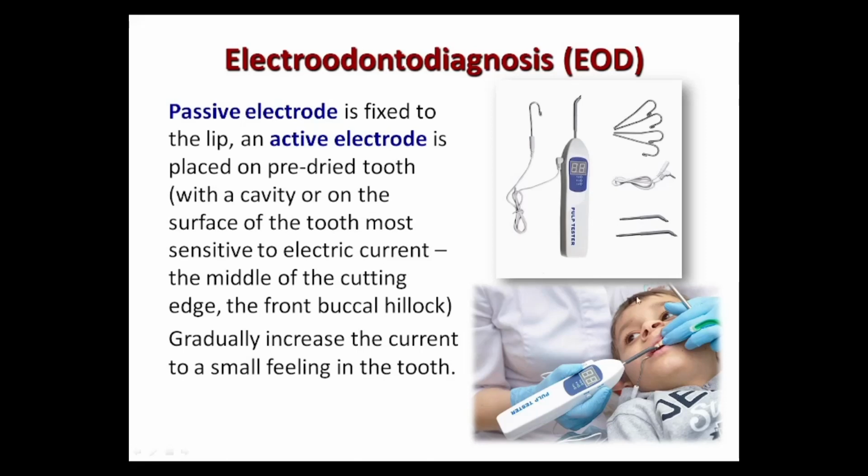Tooth with cavity or on the surface of the tooth most sensitive to electric current, for example, in the middle of the cutting edge or front buccal hillock.